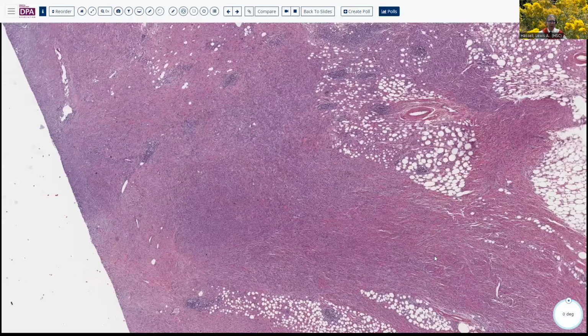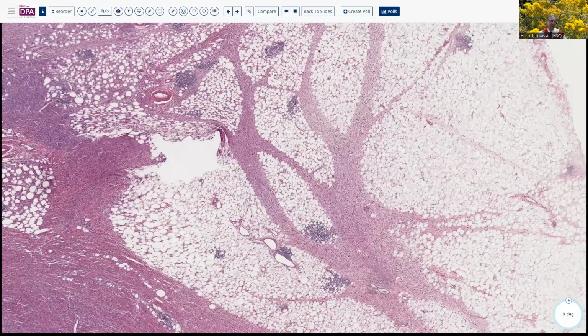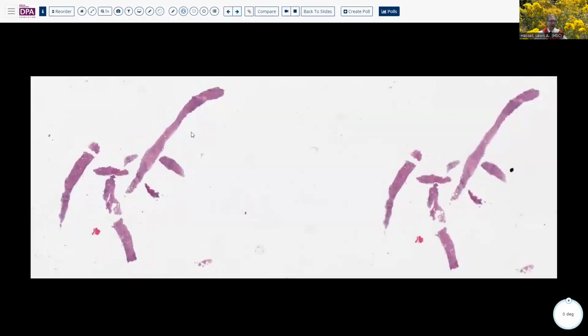And important to be aware of that inflammatory component, particularly in the early stages, in the less dedifferentiated, the well-differentiated component of this tumor. Now, another entity that can masquerade here, of course, is the IgG4 related disorders that involve the liver, biliary tract, and pancreas.